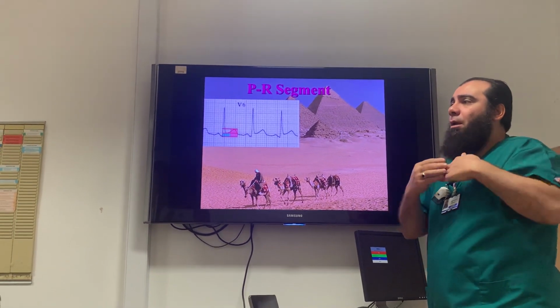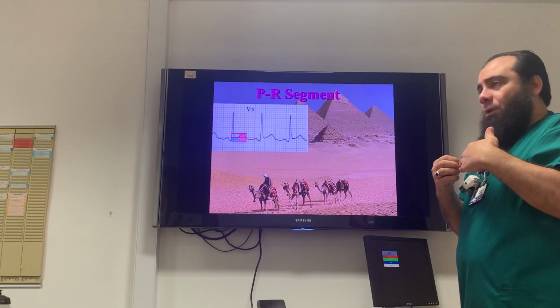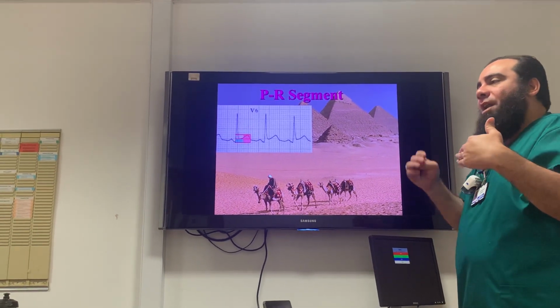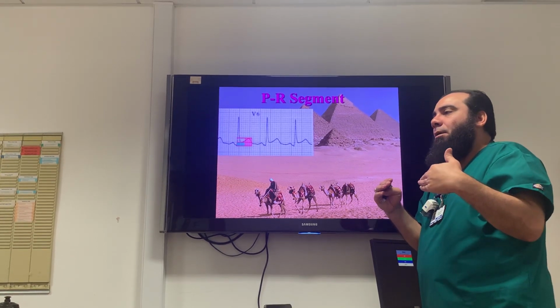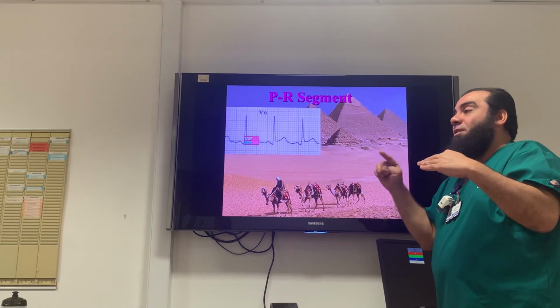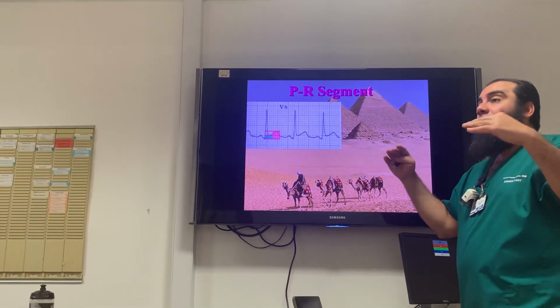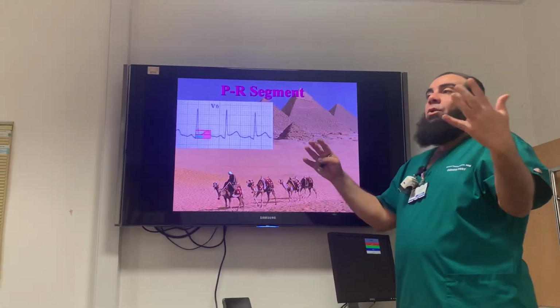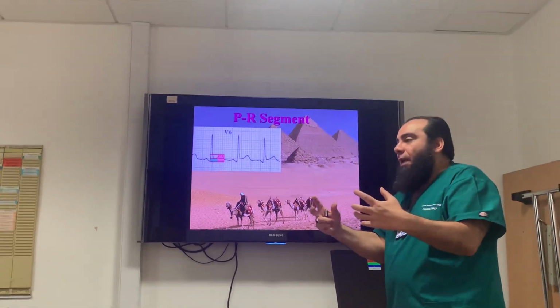I guess so. Why? Pericarditis. Absolutely. What is the baseline? How can I assess the baseline in an ECG? The line just before you enter P. Yes, from the end of T to the start of P is isoelectric, no electrical activity at that time.